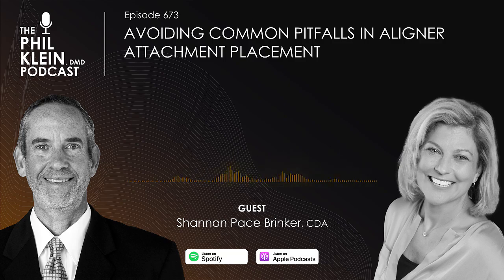And listen, I keep packing it and packing it and packing it. And we want to slightly overfill that shape, because the problem is, I think in dentistry, we're so beat up to save material, and not waste product, but we need to pack it into that attachment template window. So this way we slightly overfill it. Then we know when we seat it on the patient's teeth, of course it's going to squeeze out. But what I do is when I seat it, and I pack all the composite into that.